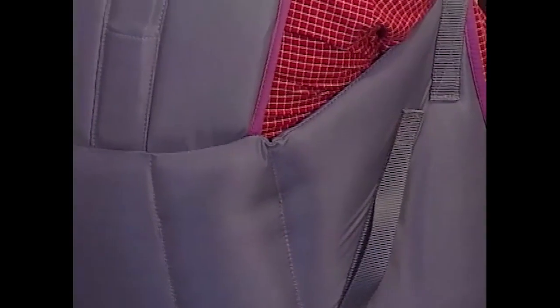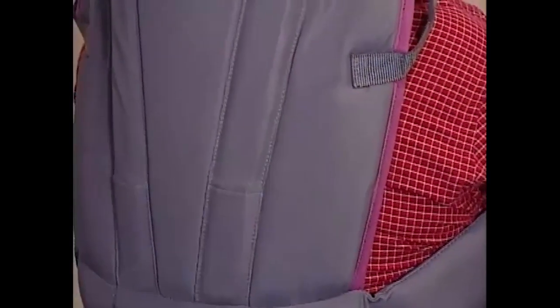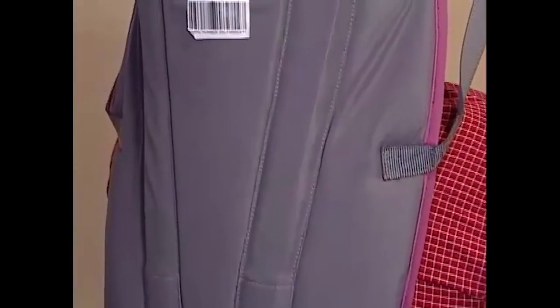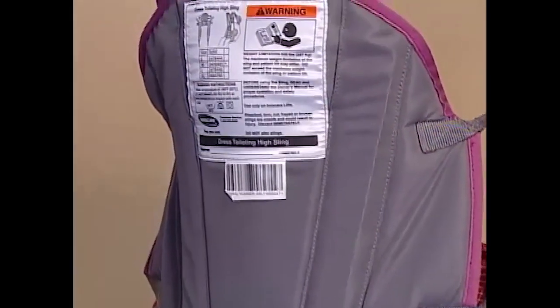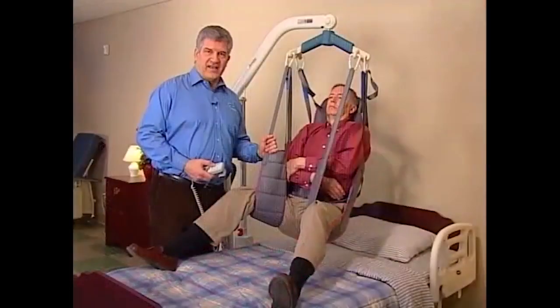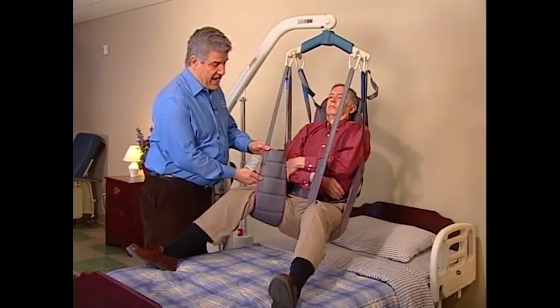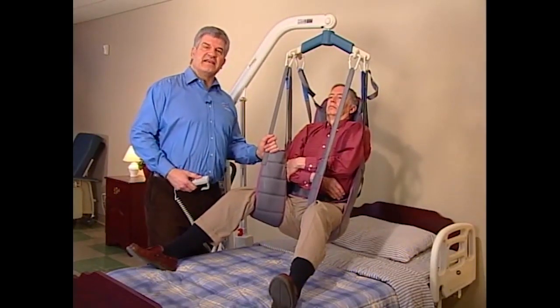InvaCare toileting slings are constructed of durable materials that resist deterioration from moisture and laundering. They're constructed of a unique, fully padded fabric that forms a soft yet supportive surface. The soft lining helps prevent sliding for comfort and skin protection, and its stretch-resistant character helps them hold their shape for superior comfort and ease of positioning.